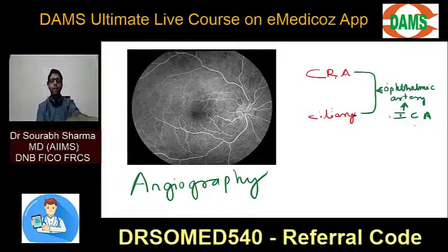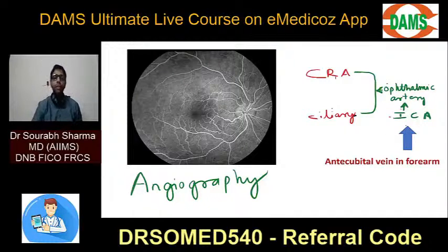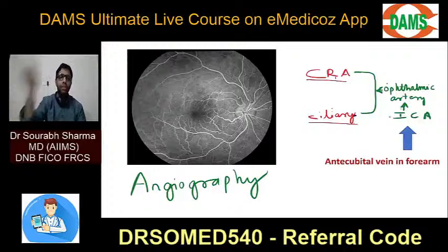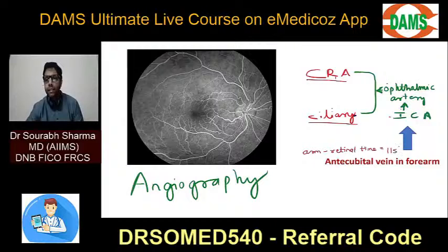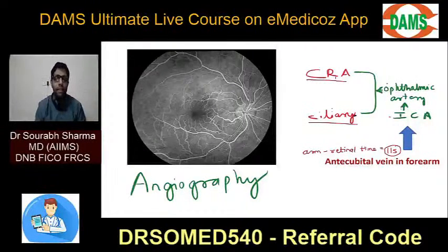We put it in the forearm, the antecubital vein in the forearm. The injection of the dyes is put in the forearm. Then it goes from the vein into the heart, then into the arterial circulation, and then it comes into the retinal circulation and choroidal circulation. This is how the dye reaches from the arm to the retina in 11 seconds. Arm retinal time: arm to heart, heart to retina, is 11 seconds.